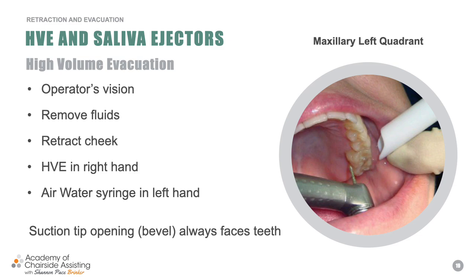So I am going to have common sense here and know that I'm going to be in that maxillary left quadrant. I'm going to be on the cheek side, right? I'm going to be on the cheek side. So I'm going to be pulling that cheek area out and making sure that I know I'm going to be on that maxillary left quadrant, and I'm going to be on the inside of that cheek.